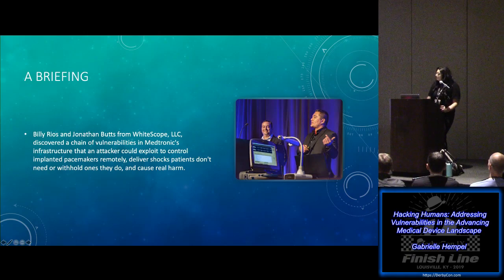The vulnerability was discovered and publicized by Billy Rios and Jonathan Butts from Whitescope, LLC. They uncovered a chain of vulnerabilities in Medtronic's infrastructure that an attacker could exploit to control implanted pacemakers remotely, deliver shocks patients don't need or withhold ones they do, and essentially cause real harm.